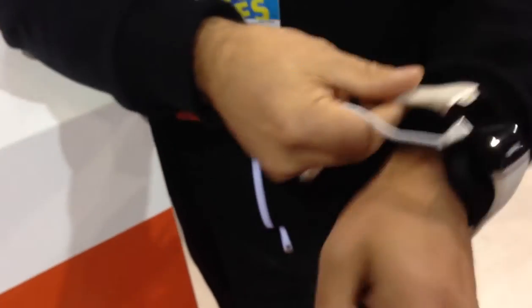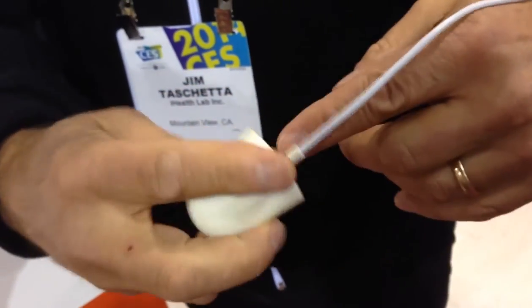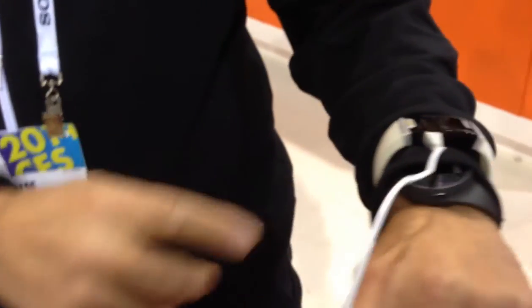Here's our continuous Pulse Ox. This will read continuously for 12 hours. It straps on your wrist — it's a lightweight device — and then the finger glove goes on the finger. So you can comfortably leave this on and it'll read 12 hours worth of data.